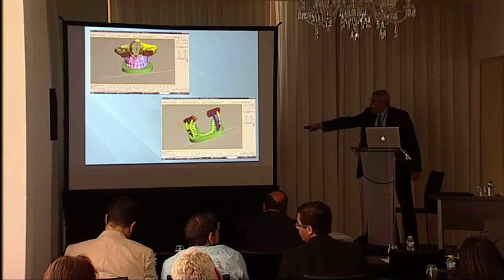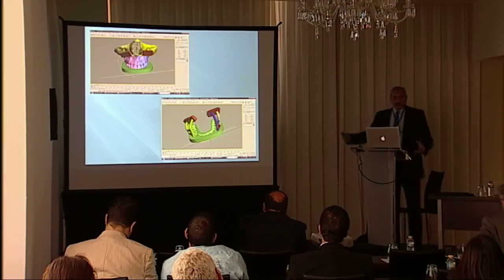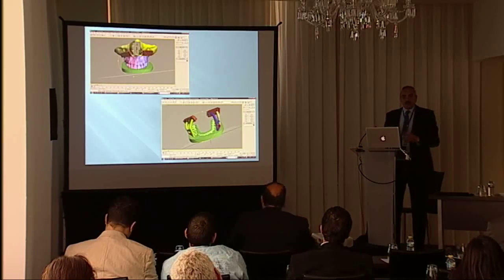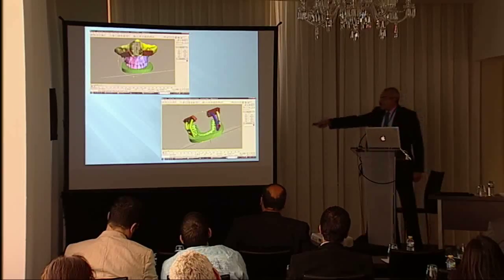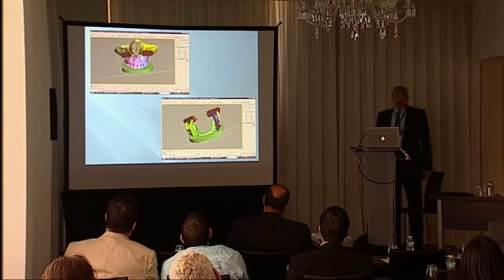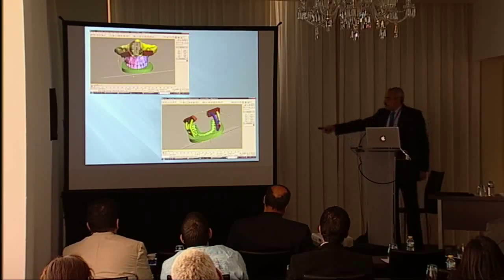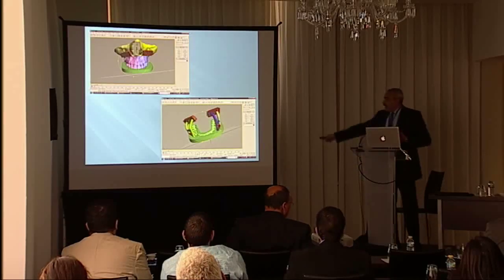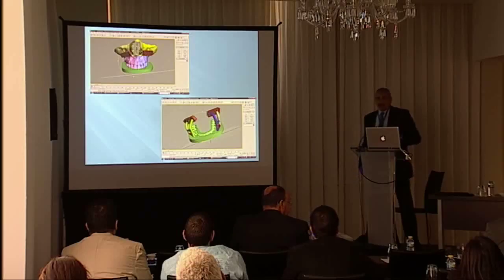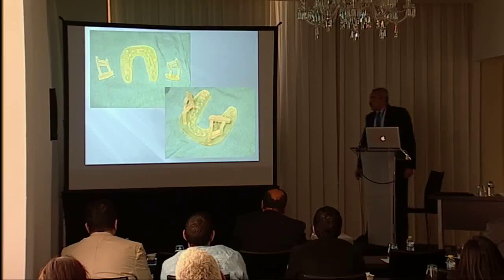Here we do a box, and on this box we do what we call, in the software, Boolean operations. We ask the computer to remove the teeth from that box, so it ends up like a wax bite that fits in place. And these arms fit on the zygoma. We'll see them now. And the connecting arms, having holes, when they fit inside each other, that denotes the maxilla in the exact planned postoperative position.